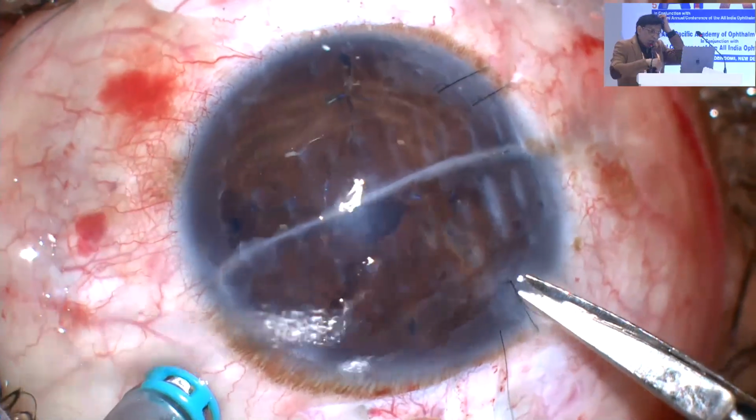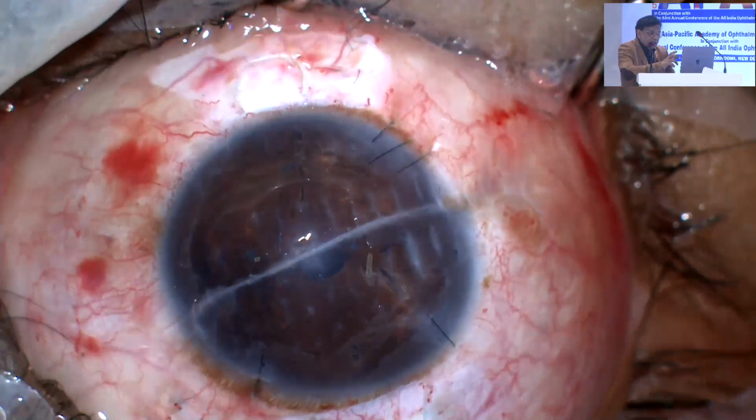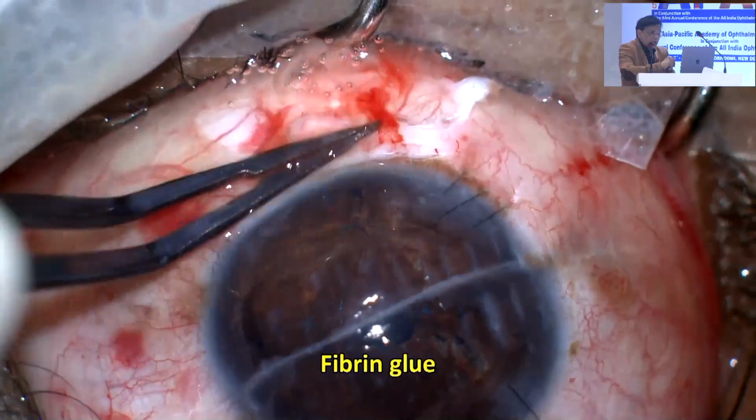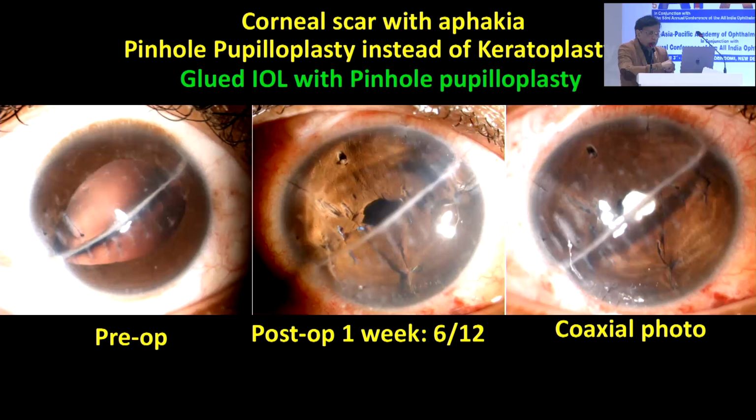Question comes, how did this patient behave? So the idea of this video was to show you, in cases like these bad cuts which you will see there, injuries, etc., you can do the glued IOL followed by the pinhole pupilloplasty as I'm showing here. And look at this patient here. Pre-op, post-op 1 week, patient improved immediately to 6/12. That is just to show you a coaxial photo of the same case.